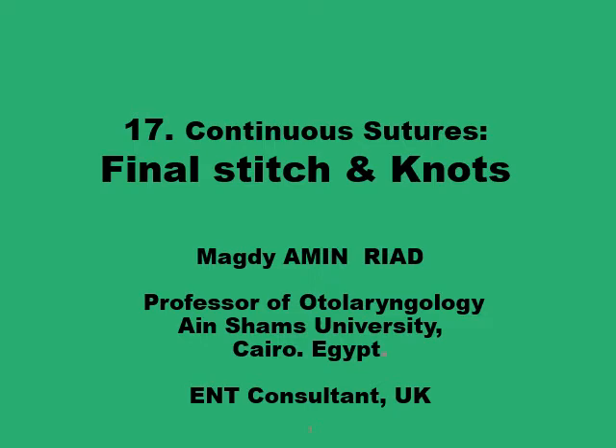This presentation is about how to finish up a continuous suture if you are using one of the several patterns of continuous sutures and you just want to finalize the suture line.